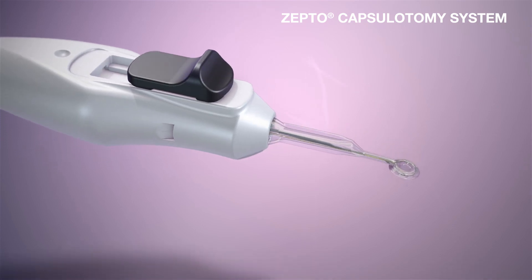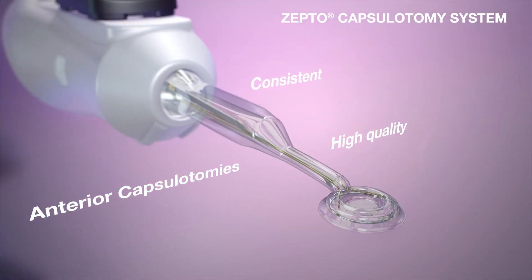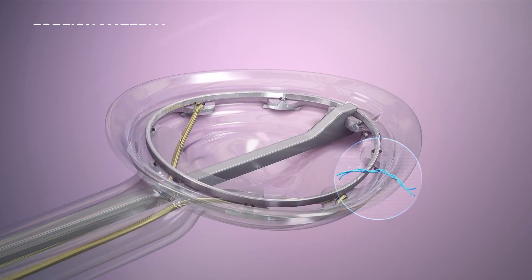The Zepto Capsulotomy system provides consistent high-quality anterior capsulotomies during cataract surgery. To begin, inspect the capsulotomy tip for a dislodged pushrod or the presence of foreign material.